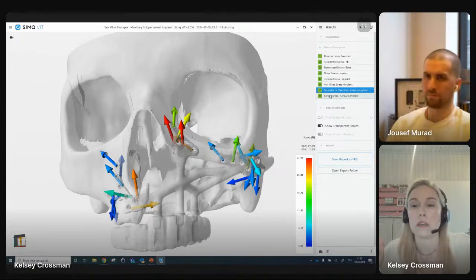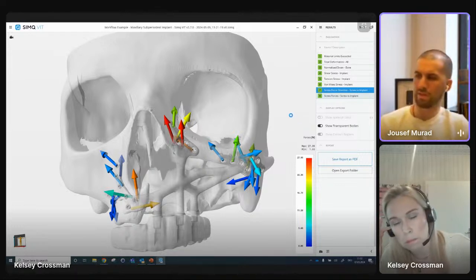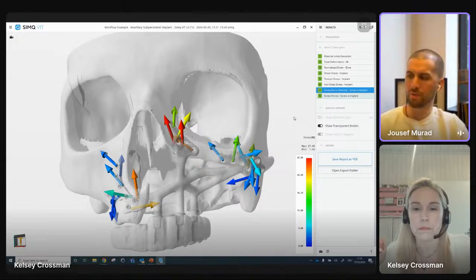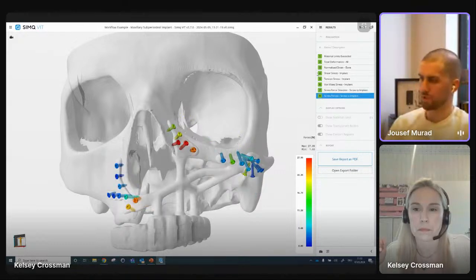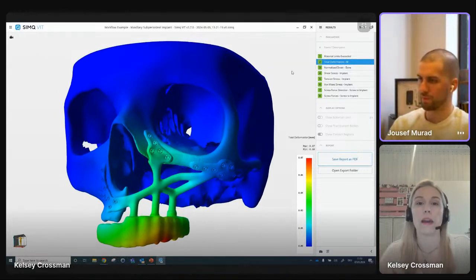So those are the results very quickly for this, the most complex flow. I like that also, Cassie. Yeah, also in terms of communication, the engineer or the designer can look at the quantitative results from an engineering point of view, but then the physician or the doctor just looks at red bad, green good, which is a much simpler way to understand. Exactly.